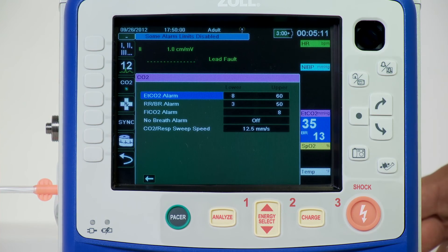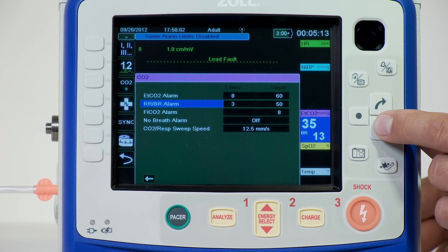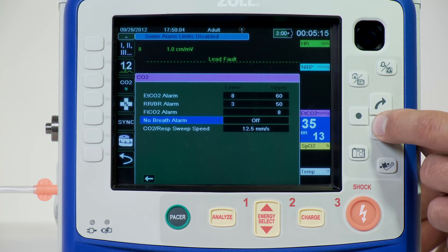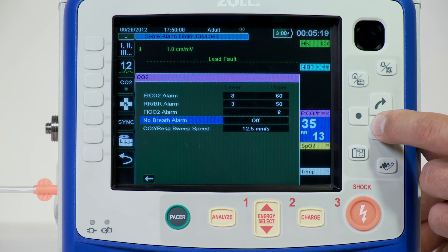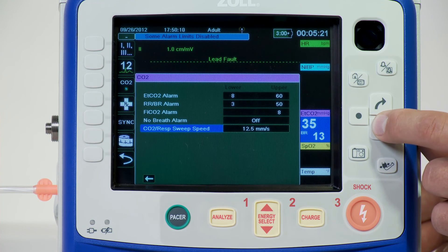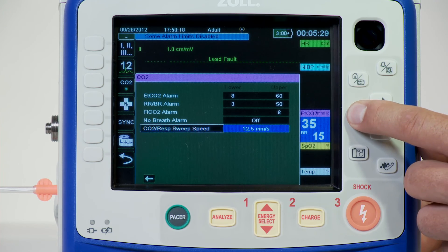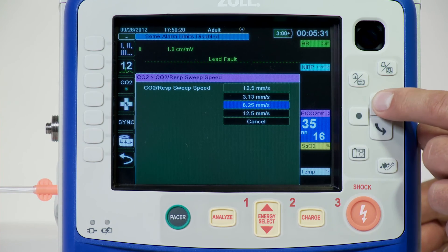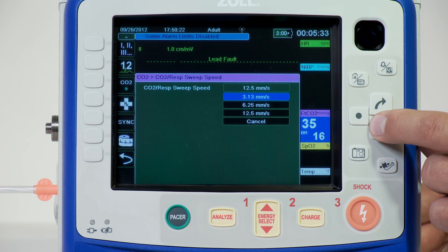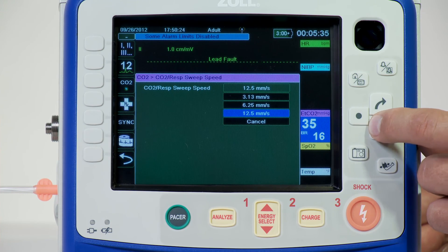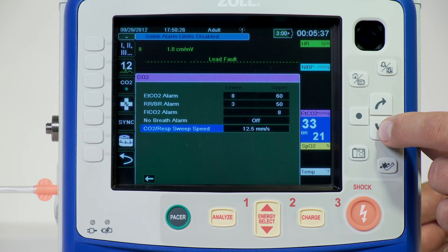You can enable or disable CO2 alarms and set upper and lower alarm limits, turn on or off the no-breath alarm, and configure the non-breathe alarm time limits. Use the navigation keys to highlight and select the CO2 numeric display to display the CO2 parameter control panel. For patients with slower respiration rates, a slower sweep speed will make the capnogram easier to view. You can adjust the speed using the CO2 parameter control panel.